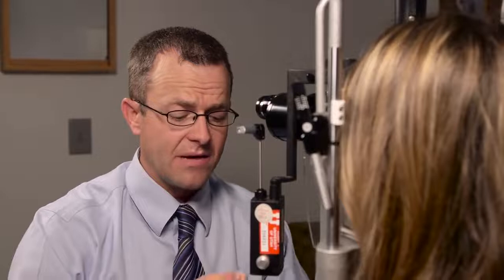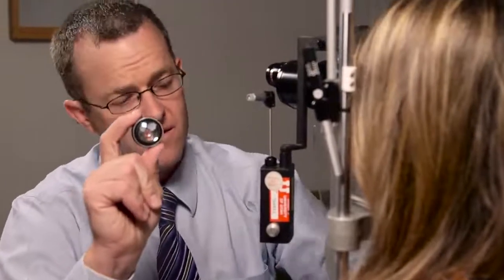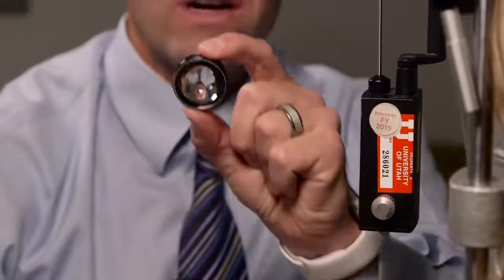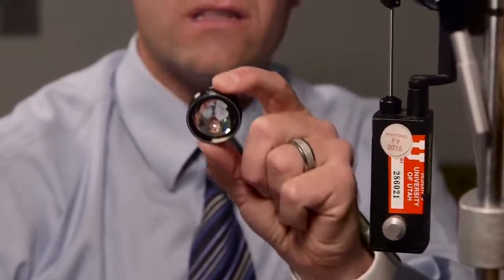Commonly, there are two main types of lenses that you'll use. The purpose of lenses in doing a retina exam is to be able to magnify the images in the back of the eye. The common ones that are used are a 78 diopter lens and a 90 diopter lens. I'm using a 78 diopter lens. And there's some little tricks to be able to pick up the posterior segment of the eye or the retina using this lens.